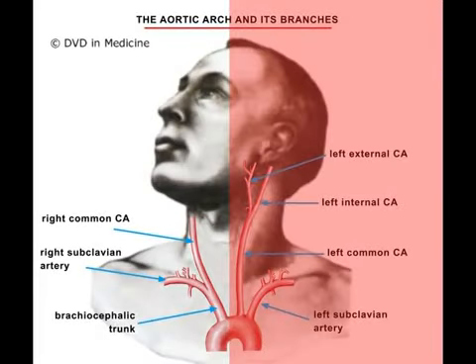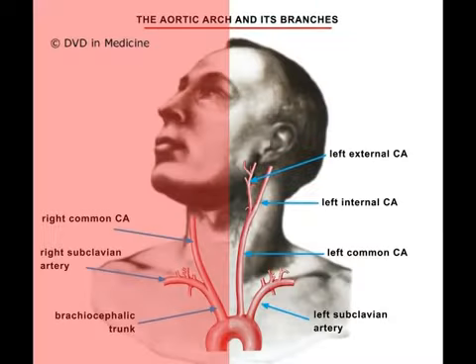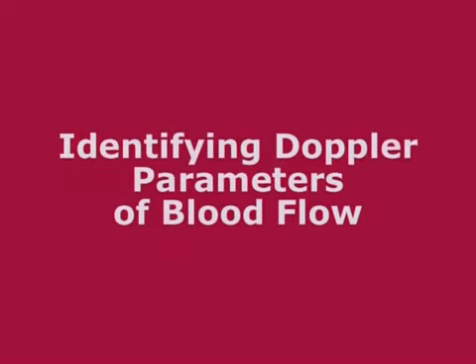After one has identified the course of vessels on one side of the neck, the same procedure must be performed on the other side. Identifying Doppler parameters of blood flow.